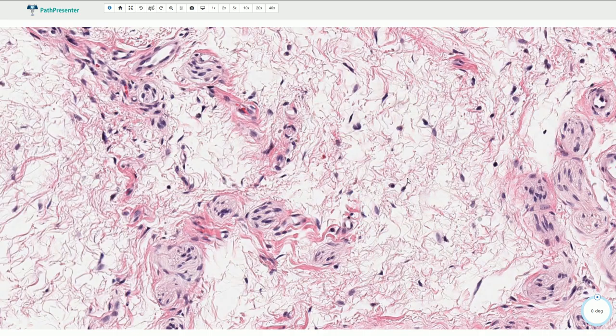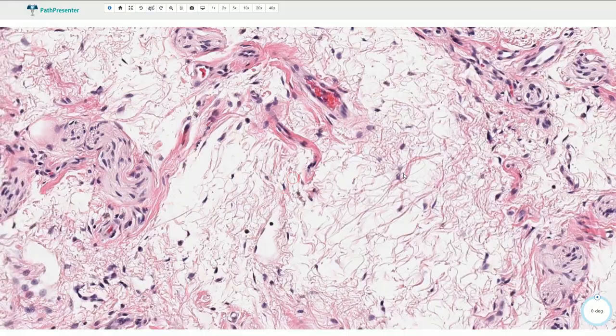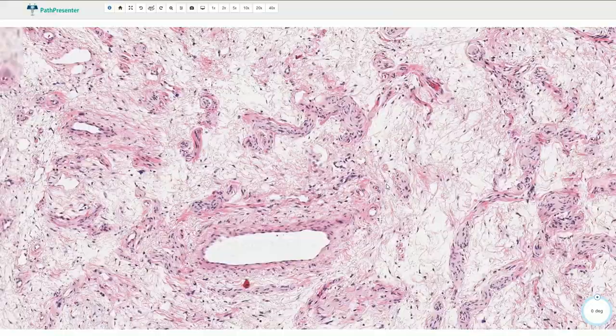Here we have a cell with the typical appearance of the cytoplasm. The nuclei are dark but they are not atypical. We do not see many mitotic figures. The blood vessels form the second component of the tumor, and they are usually medium or large.